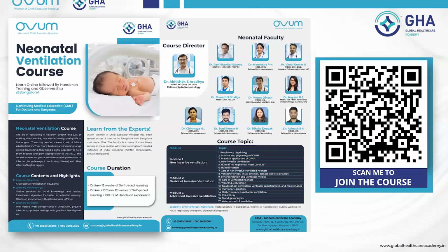And now we have cost-effective transport CPAP. What our TPs are giving you is 100%. It doesn't have inbuilt air. So we have come out with an innovation where you have an inbuilt compressor and an inbuilt FiO2 monitoring, and it just requires an oxygen connection for delivering CPAP with air and oxygen, and maybe an add-on humidification will help in the immediate few hours also. The other thing, I think we still need to innovate on how we convert this Rams cannula into a better CPAP interface. Maybe you can all work on improving the efficacy of Rams cannula CPAP.